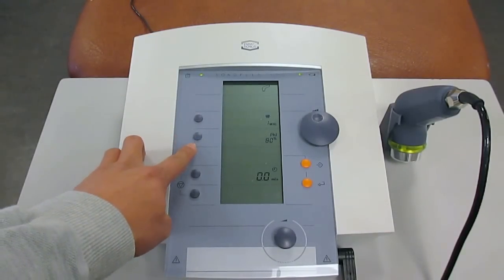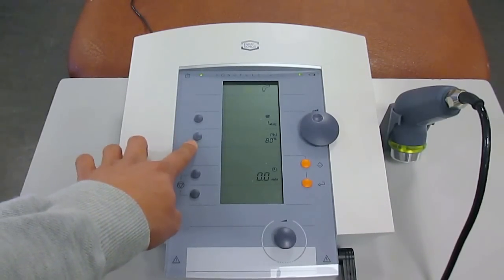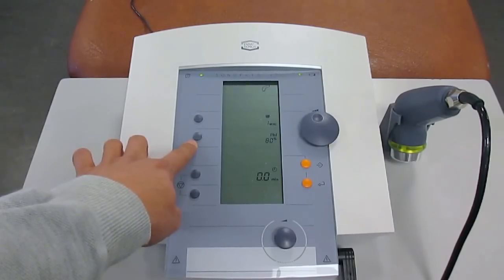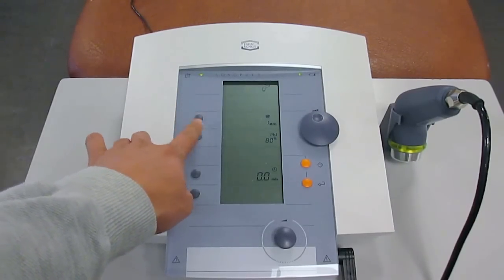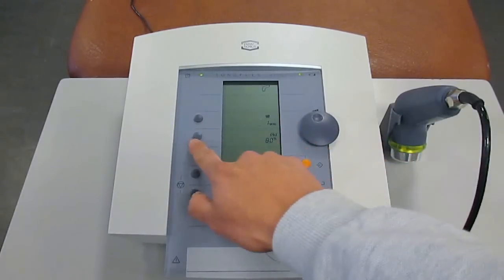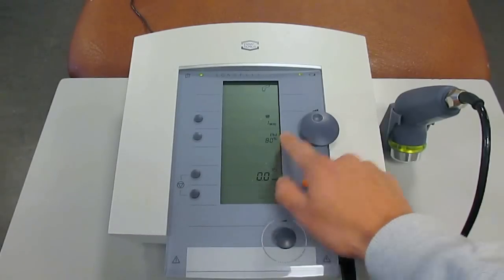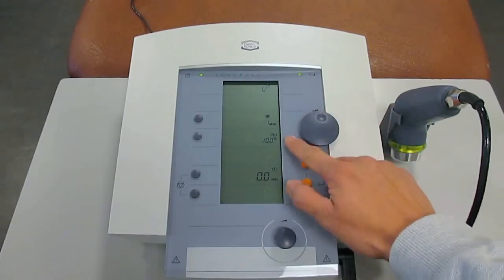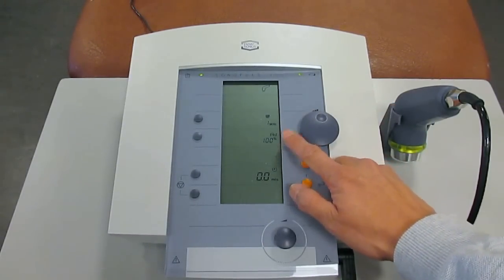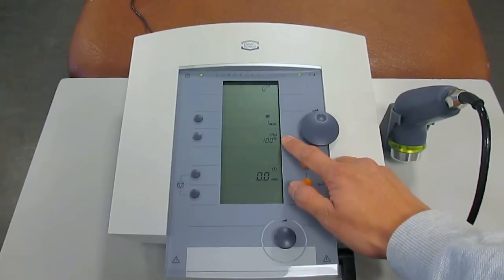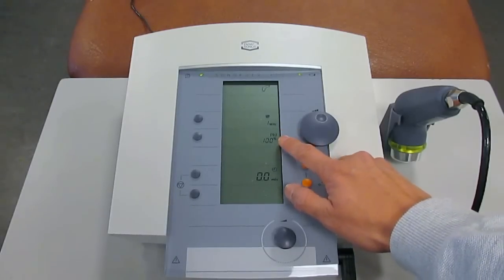This is the button for controlling the pulse percentage or pulse duration. For continuous ultrasound, what you do is when you push this button over here, you turn the dial to turn it up to 100%. That will give you continuous ultrasound. However, if you want to change that to a slightly lower percentage, simply turn on the dial to lower the percentage.